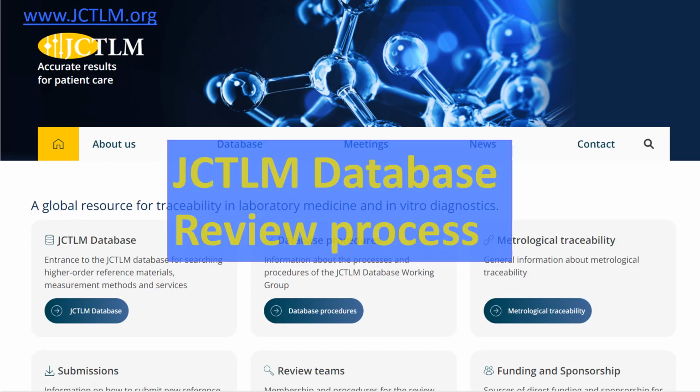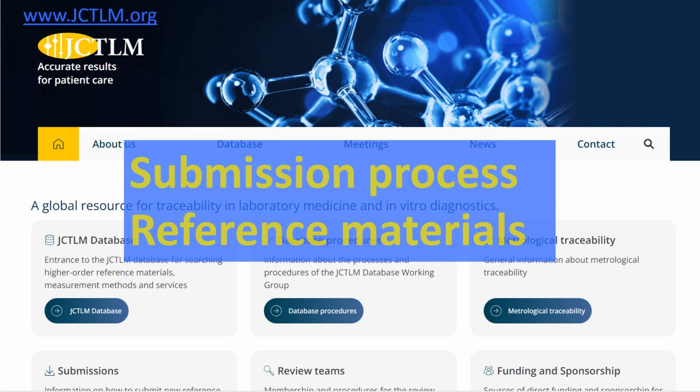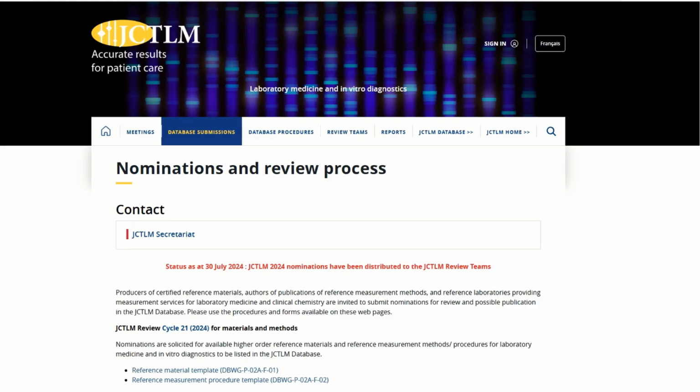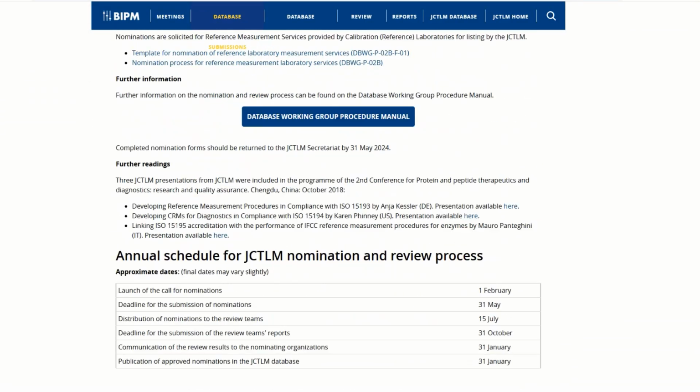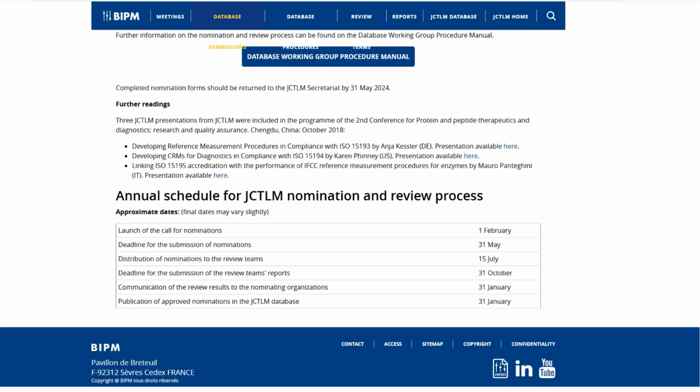Welcome to the instruction videos for the JCTLM database review process. This video will provide more information and guidance specific for the submission of certified reference materials for listing in the JCTLM database. It is recommended to become familiar with the submission process, the requested information, and the relevant quality and standard requirements well before the deadline of the submission cycle, as it could take a considerable amount of time to collect and clearly document the required information.